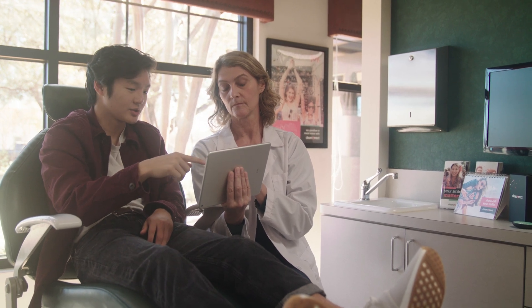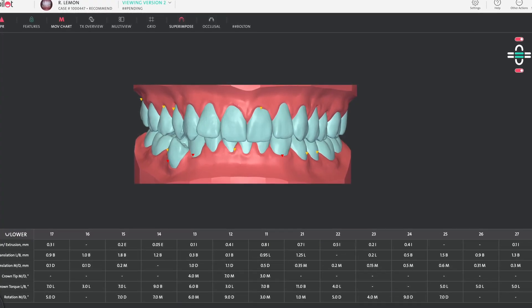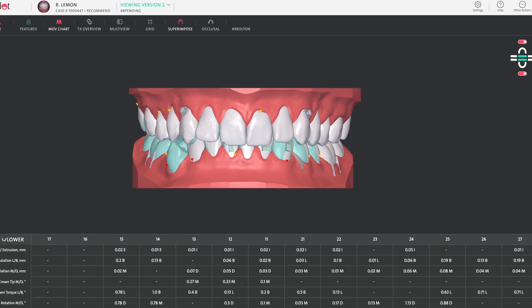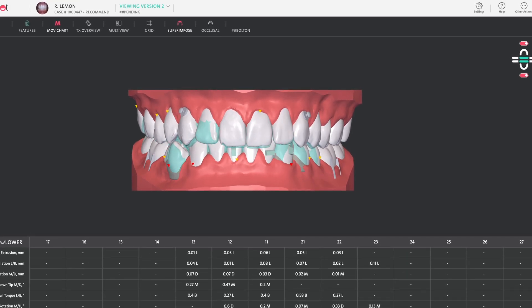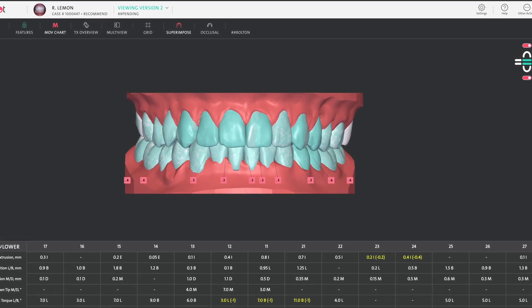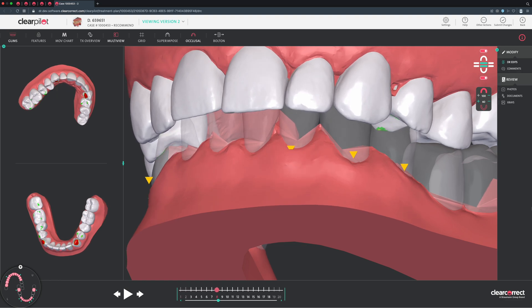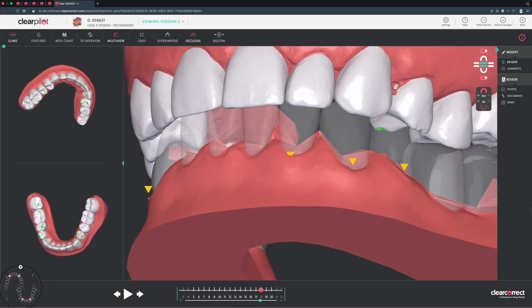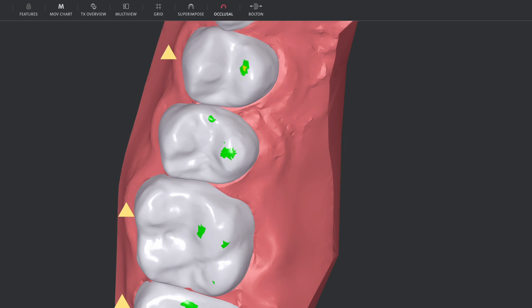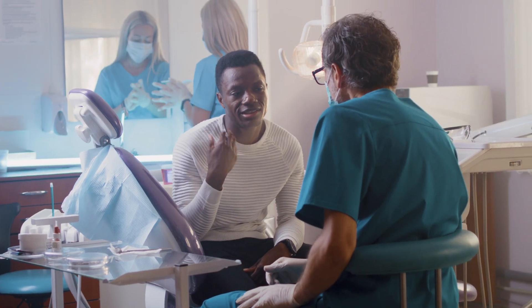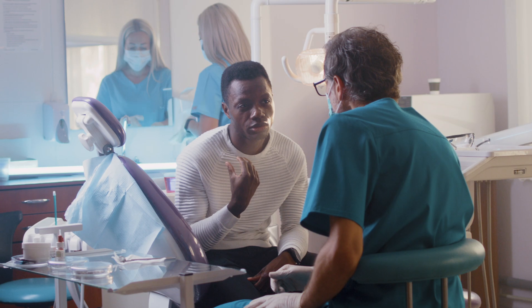With ClearPilot, you can view details on position and movement for each tooth while visually comparing any step of treatment to the starting position. You can also evaluate your treatment setup from multiple angles simultaneously while examining occlusal contacts at each step of treatment. These tools don't just support your clinical evaluations — they can also help engage and motivate patients by visualizing progress and goals.